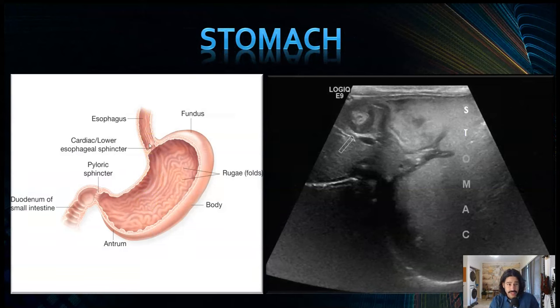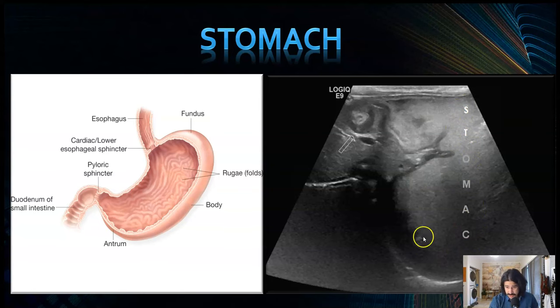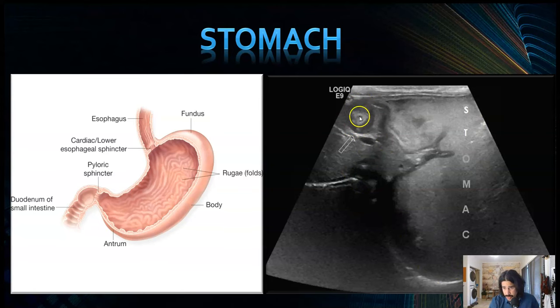The esophagus goes into the stomach. What separates them is the esophageal sphincter. Then you have the fundus, the rugal folds, the body, and the antrum. Once stomach contents — chewed food and liquid — get to the antrum, they pass through the pylorus and into the first part of the duodenum. Here's an image of a baby's stomach — very filled. The antrum is here, the body here, and the fundus down here. The pylorus is thickened here — this patient had pyloric stenosis. With pyloric stenosis, the stomach contents can't get past, so eventually there is projectile vomiting.